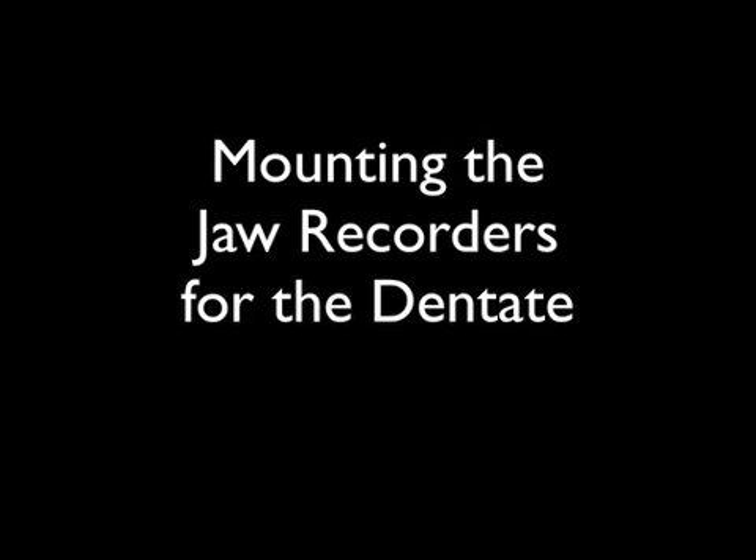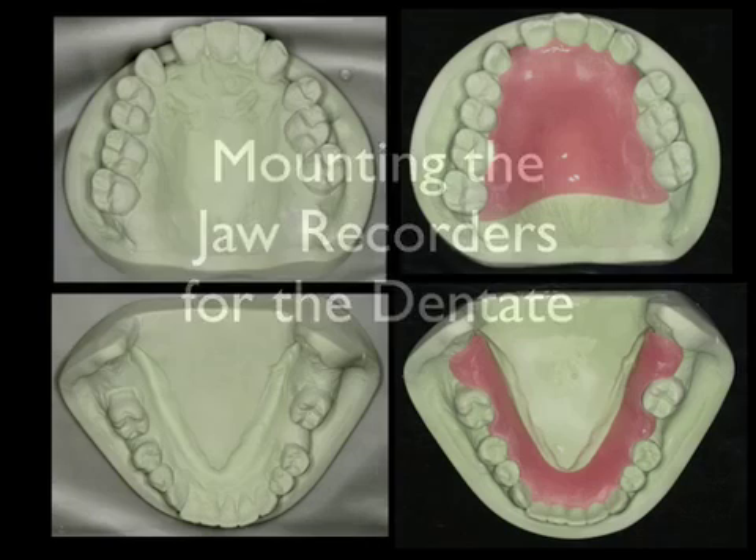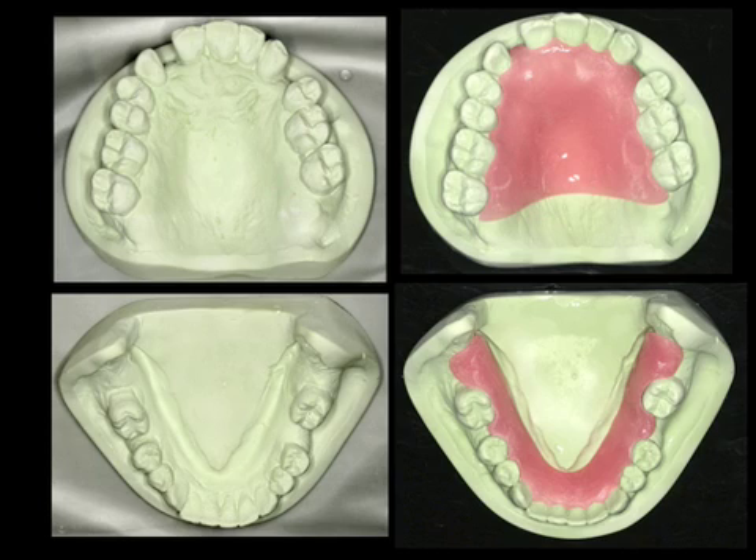We are now going to discuss mounting the jaw recorders for the dentate patient. This patient will become edentulous. As seen here, we have maxillary and mandibular models on the left, and on the right we have fabricated resin — both palatal and lingual resin devices — in order to mount the recording devices.